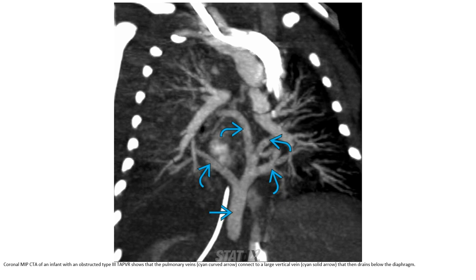This is the CTA of a patient with infradiaphragmatic Type 3 total anomalous pulmonary venous return. You can see that the pulmonary vein connects to a large vertical vein, which then drains below the diaphragm.